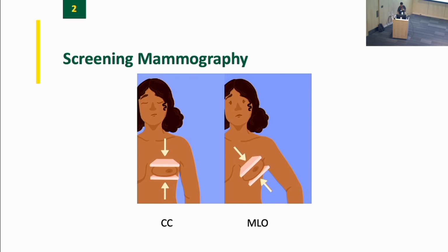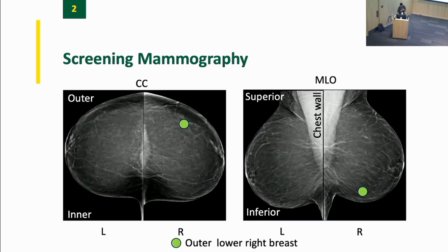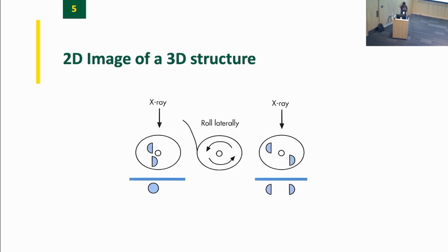And why is this important? So let me, I want to change the order of this a little bit. I think it's very important to note something about breast imaging and radiology, any 2D imaging in general. We are taking a 2D image of a 3D anatomic structure, okay? That means you're getting a projection of the image. So just like in the chest X-ray example yesterday, you're shooting through the back of the patient or the front of the patient, everything that beam passes through between the source and the detector is represented on the image in a 2D fashion, right? So think if you had a transparency projector.